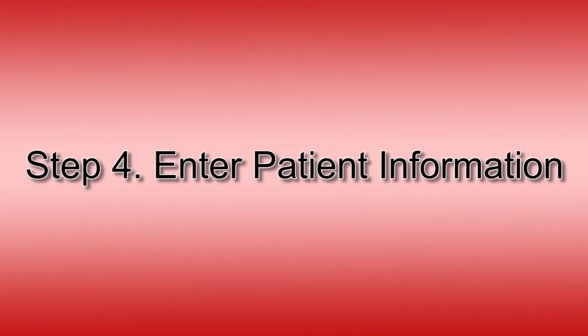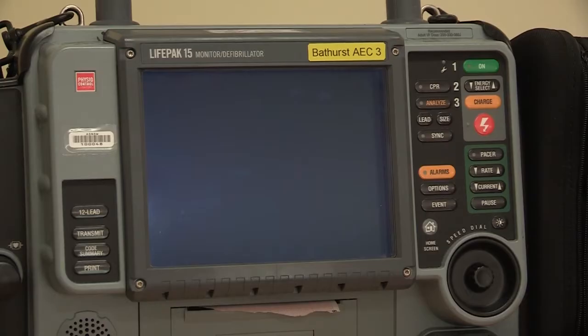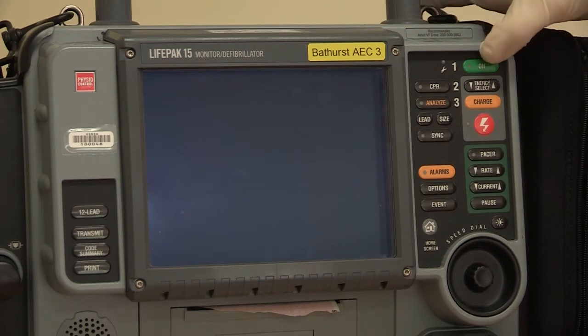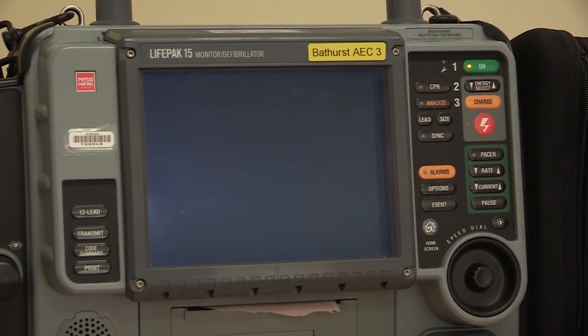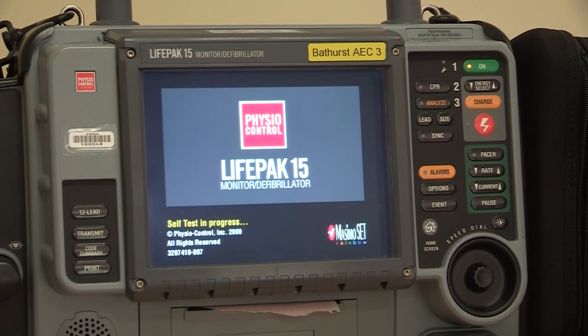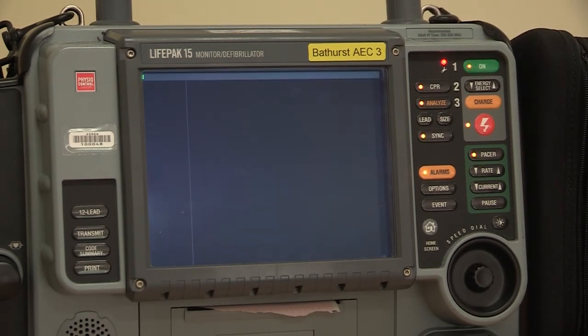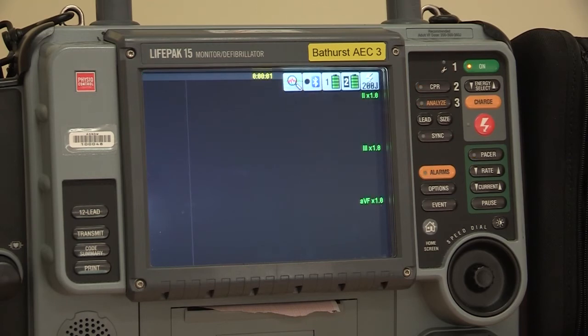Now you'll need to enter the patient's information and details. The ECG machine we are using today is a LifePak 15, and we will demonstrate how to do this using this monitor. If yours is different, you'll need to learn how to operate it accordingly.